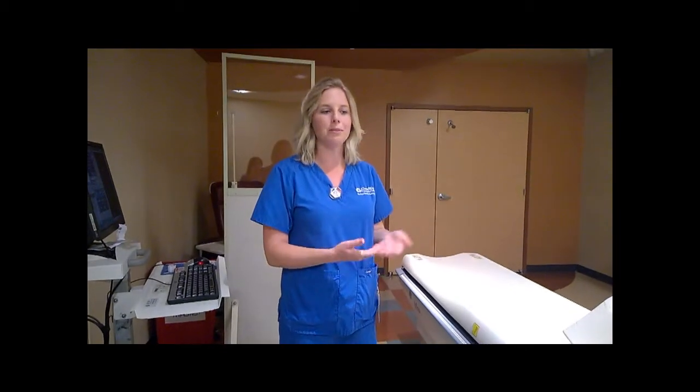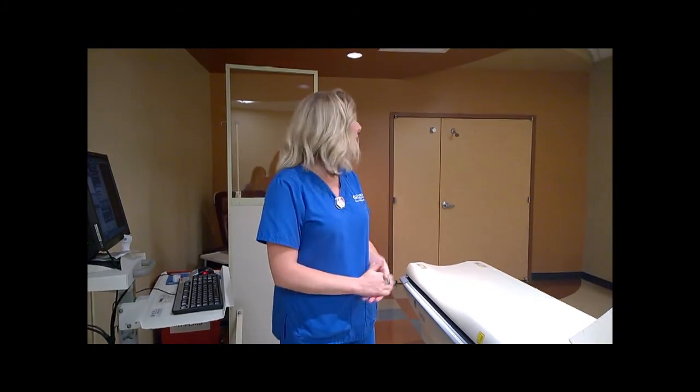Before I actually start the CT, I want to make sure that anybody in the room — if the patient has family members with them — I want them to leave the room so there's no unnecessary exposure. I'll also close the door so nobody will walk in. Outside of this door, we have a sign that lights up when the CT is actually going to make sure nobody walks in as well.